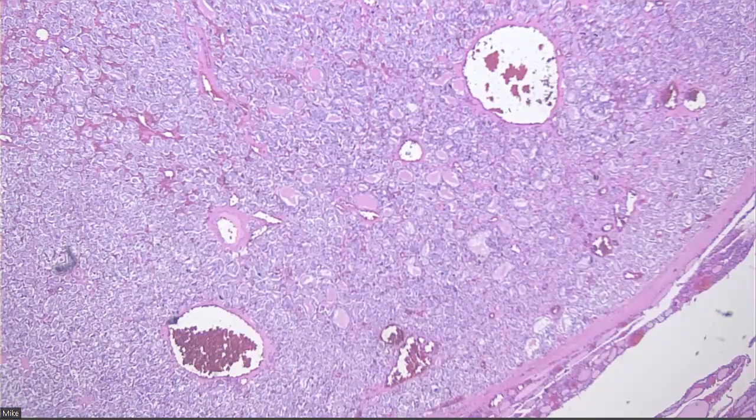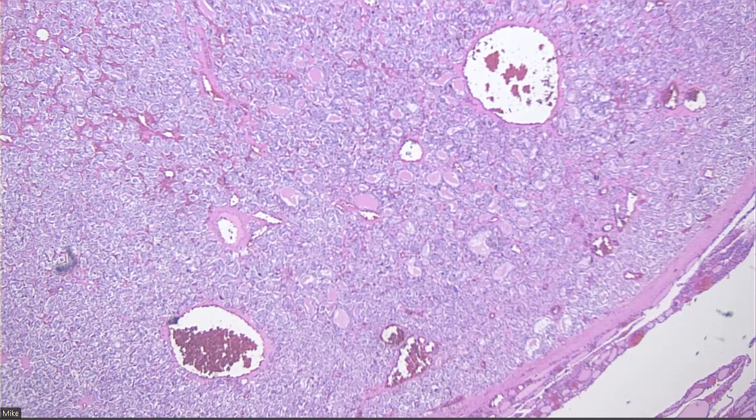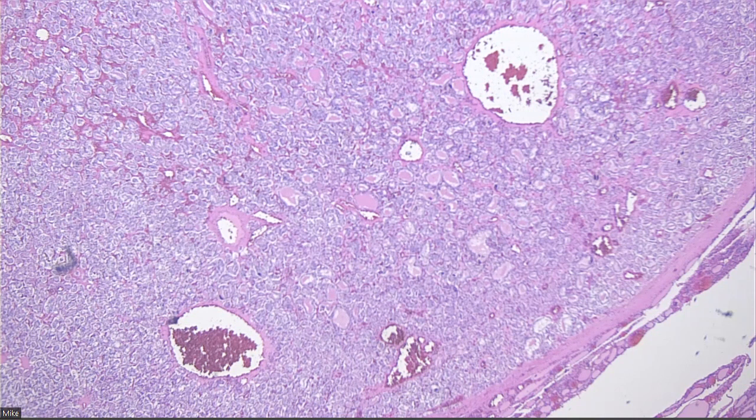I've gotten questions before, like, when do you make a comment if everything's benign or if there are multiple nodules? And the answer is, I answer their question. So if they're not FNAing anything and it's a multinodular goiter, we're taking it out for symptoms and everything's benign and there's no dominant nodule, fine, I won't necessarily address any dominant nodule.